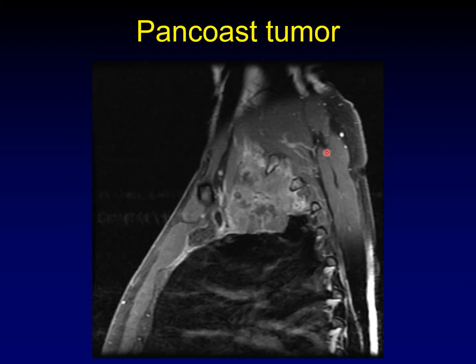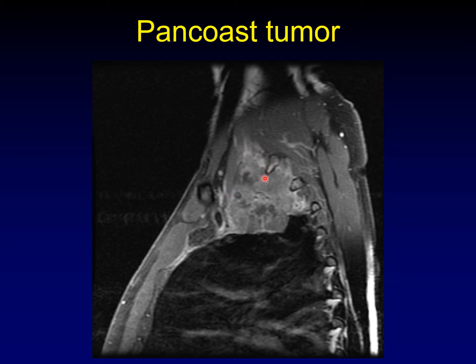Here's an example of a pancoast tumor. This mass began at the apex of the lung — it's actually a lung cancer. You can see it's very aggressive, extending into the ribs, into the chest wall, and up into the neck. Here's the anterior scalene muscle and somewhere in there the middle scalene muscle — the scalene triangle completely filled in with tumor. You can imagine how that's going to affect the brachial plexus that's supposed to be living right there.